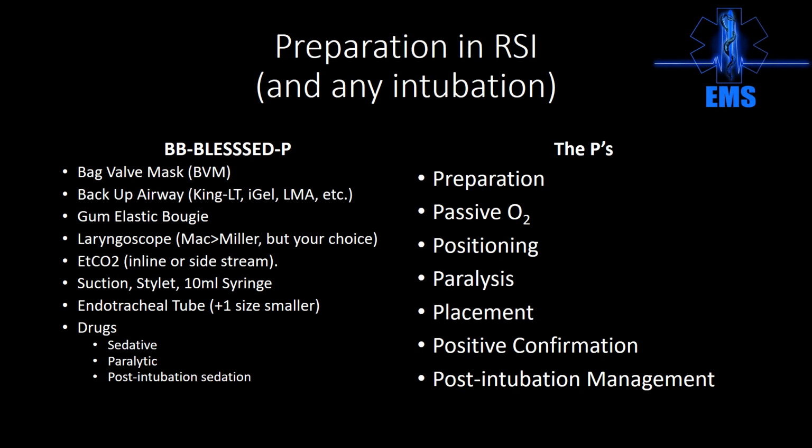That's great. You can still get that with the tube in the back of the throat. I've seen it happen where the tube was not in the trachea. It was just butted up, juxtaposed against the trachea, and I had a beautiful end-tidal CO2 readout. You need misting and fogging in the tube. You need condensation in the tube.